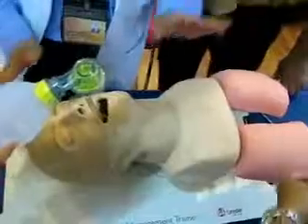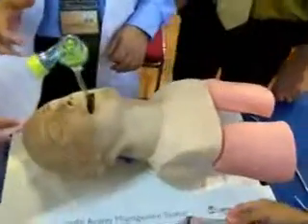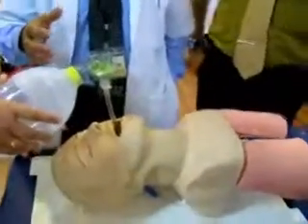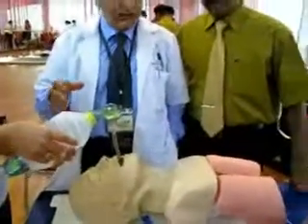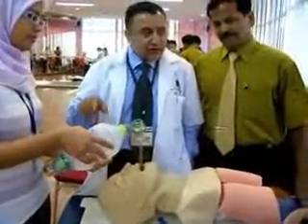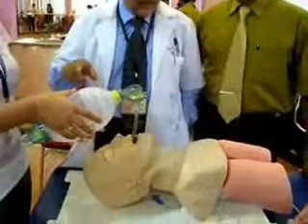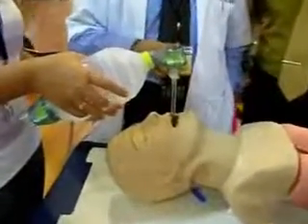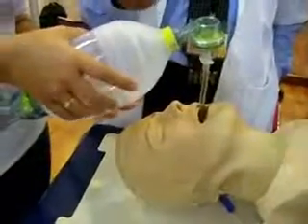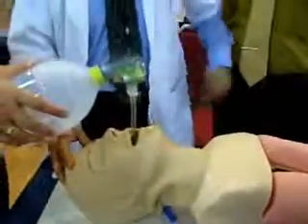After inflating 10 ml, the tube is secured. You can leave the head tilt and chin lift position and start bagging. Give 8 to 10 breaths per minute, counting within oneself: 1, 2, 3, 4, 5, 6. Continue ventilation until respiration is restored or the patient is placed on a ventilator.